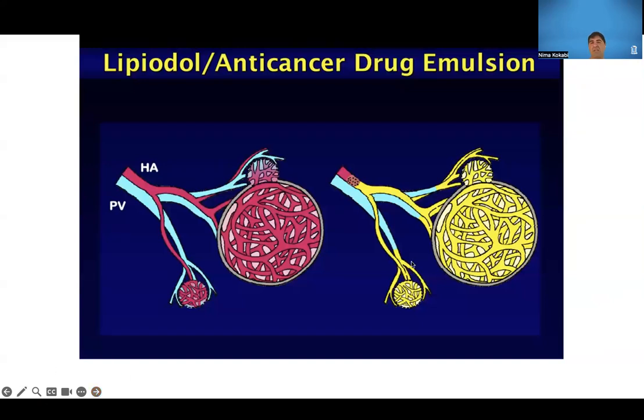The way it works is you create an emulsified liquid, a very thick liquid form of chemotherapy, that you inject into the hepatic artery. It actually crosses the arterioles and the sinusoids into the venules, which the proponents of conventional chemoembolization always point out is one of the biggest advantages of this treatment compared to drug-eluting beads, which would not have the ability to penetrate this deep.